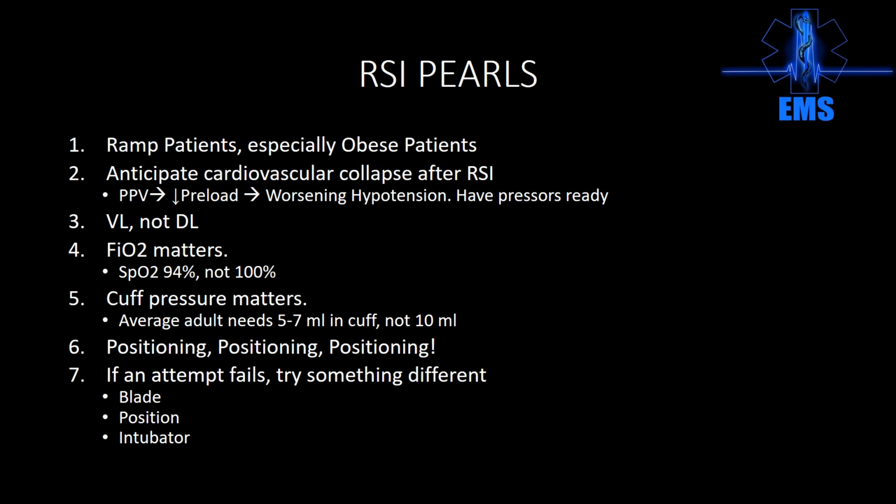Anticipate the cardiovascular collapse after RSI. This is why the patient needs to be resuscitated before you get into the situation. You're going to induce positive pressure ventilation. Positive pressure decreases the preload. If they have hypotension, you're going to make it worse. So again, have your pressors ready.